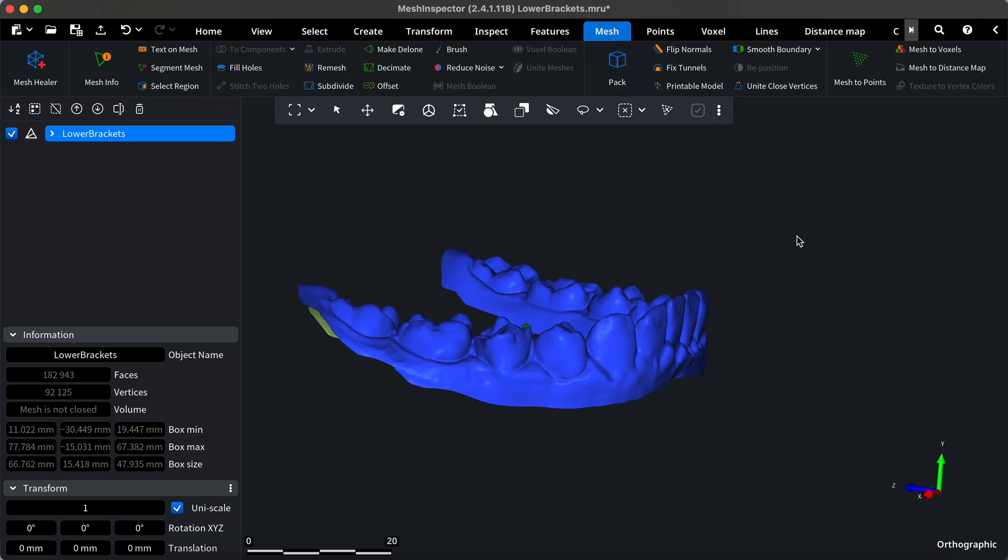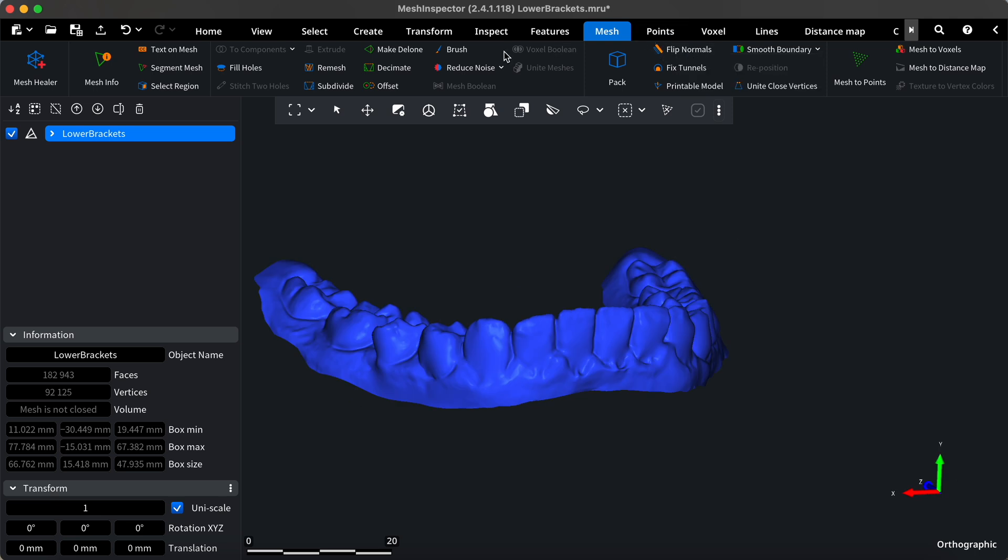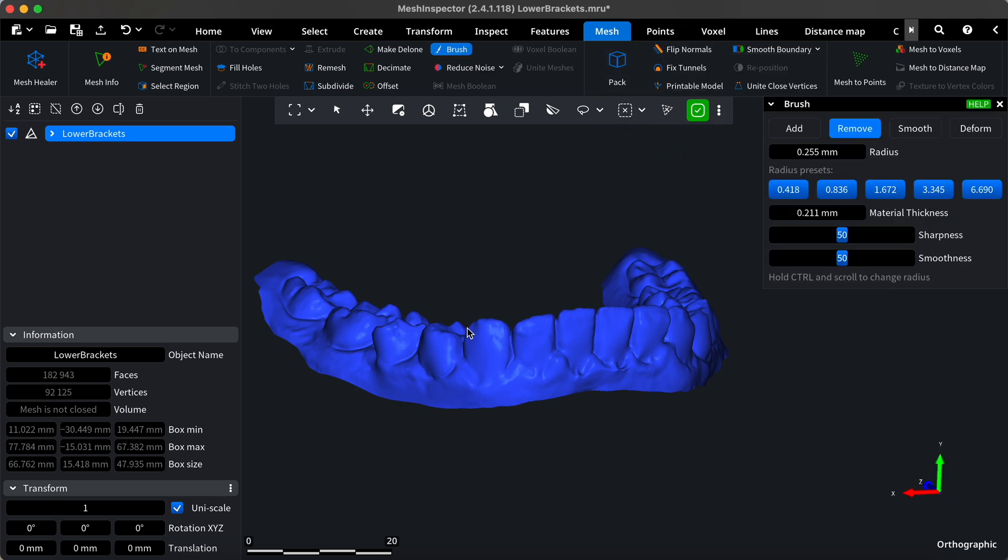Remember, you can always use the brush tool to refine the mesh locally. And that's it! We've successfully removed the brackets from our dental mesh scan, ensuring a clean and accurate model.